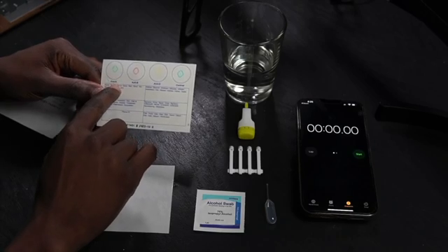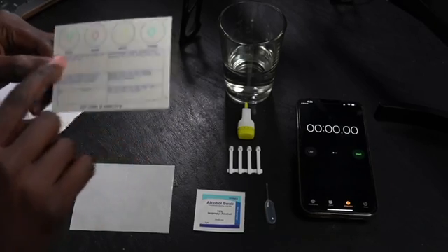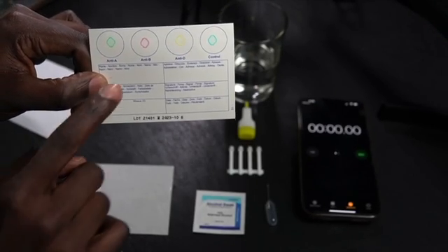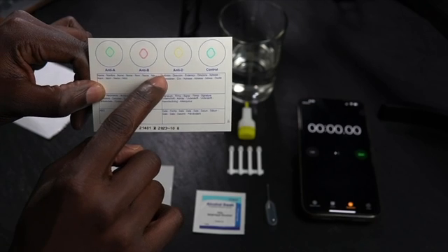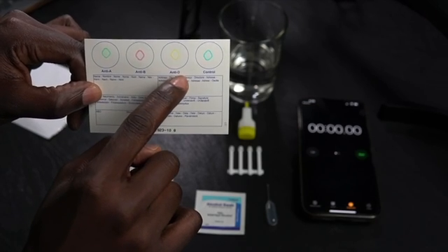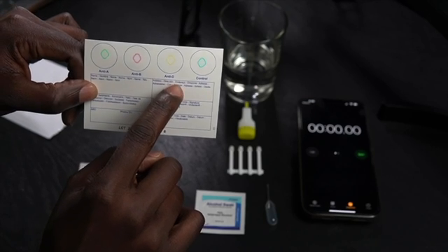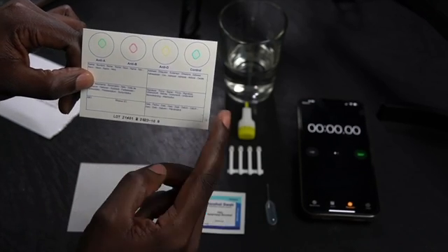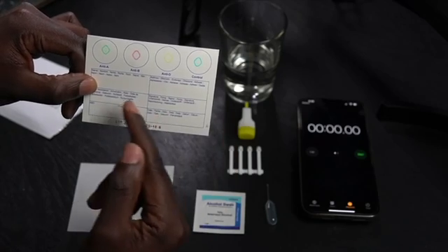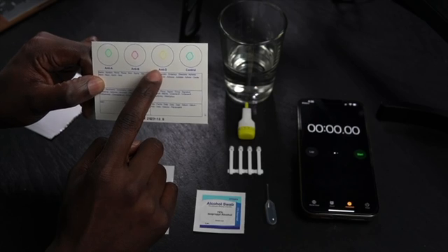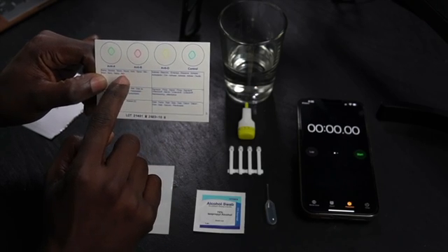In this one you can see we have the anti-A antibodies. Maybe if I bring it closer. There you go, anti-A antibodies, anti-B antibodies, anti-D antibodies. This is the one for determining if you're RHD positive or negative. And then we have the control. It basically contains all of the same stuff that we're using in all of the others, except that it doesn't have any actual antibodies. The idea is that if you see agglutination in any of these, it tells you that the antigens for these antibodies are present.